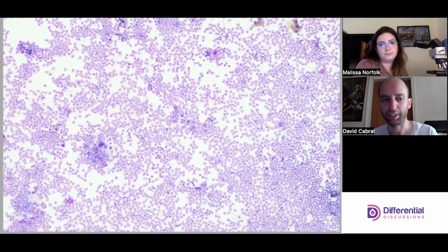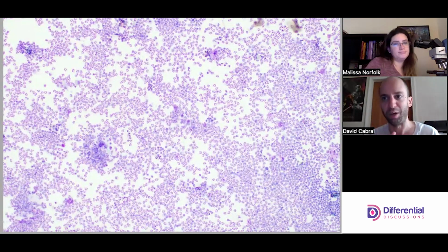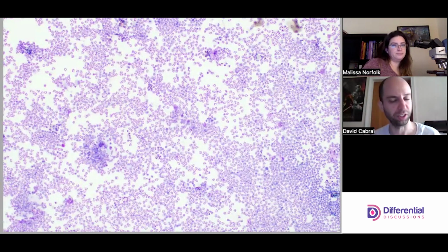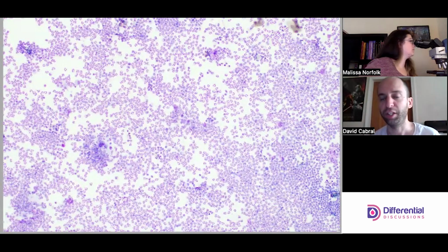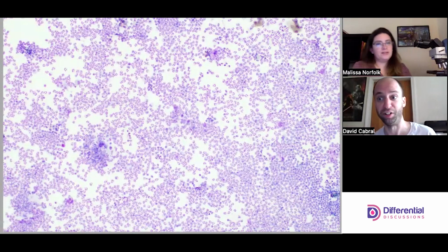It's a great point that cytospins don't have the same quality of random distribution that push prep peripheral blood smears might have. So be selective about where you go. It happens all the time where I might do a differential, count 100 cells, someone else might count 100 cells, and just because we focused on different areas, we get a high degree of variability.